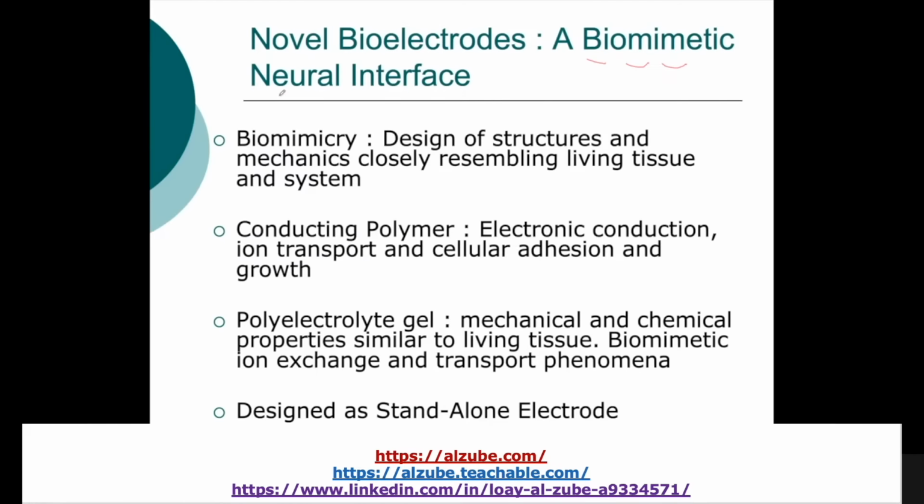What we mean by neural interfacing is that I would like to get a device or a sensor that is interfacing with neurons and communicating the signal from the neuron, the electrical signal from the neurons. By definition, biomimicry is the design of structures and mechanics closely resembling living tissue and systems.